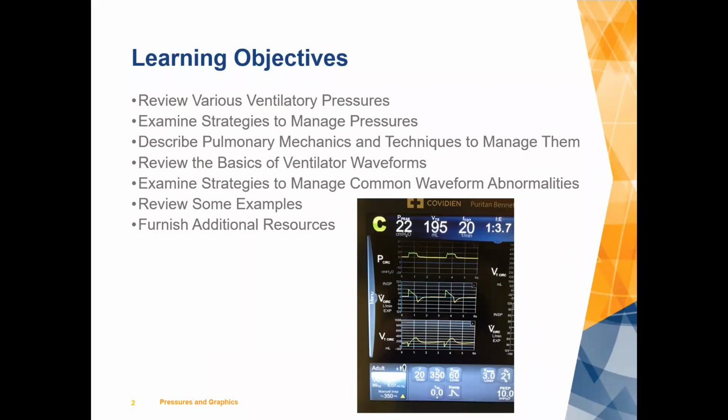We now know that if, for example, plateau pressures exceed 30 centimeters for any protracted period of time, that can induce or contribute to ventilator-induced lung injury. So that's just one example. We'll take a deeper dive on that.